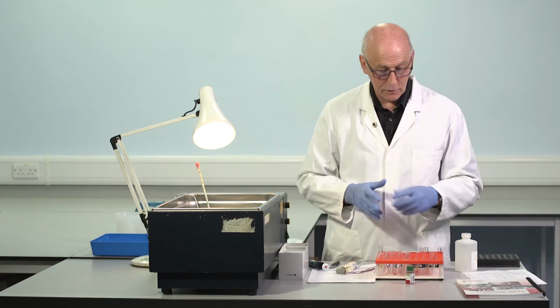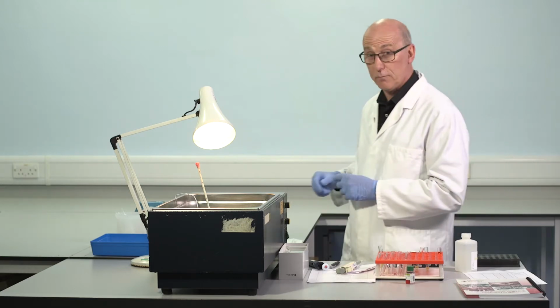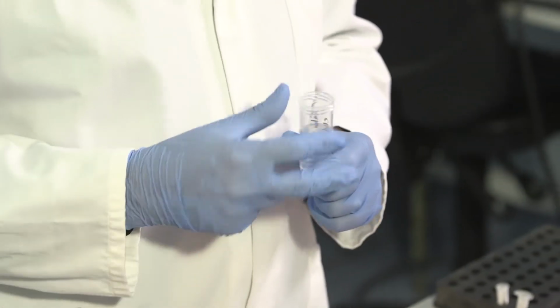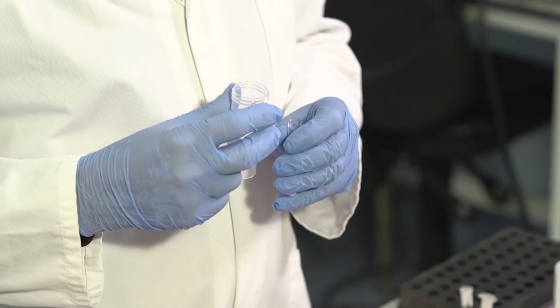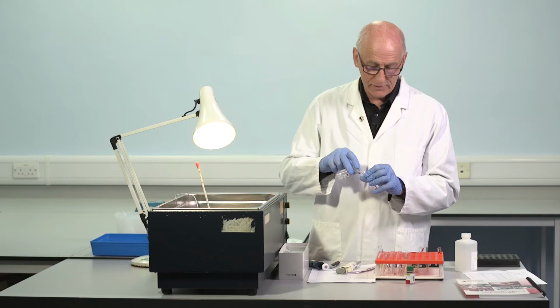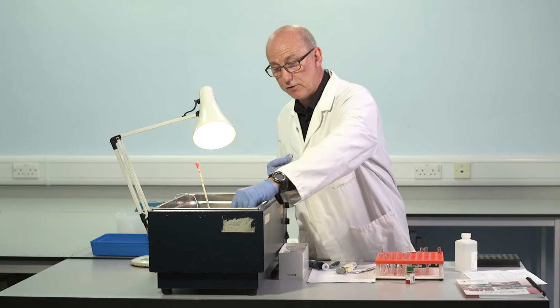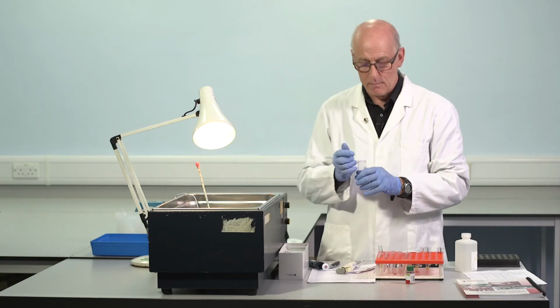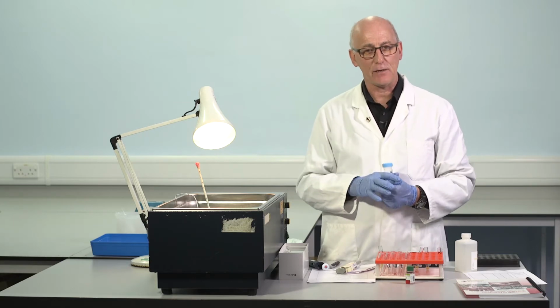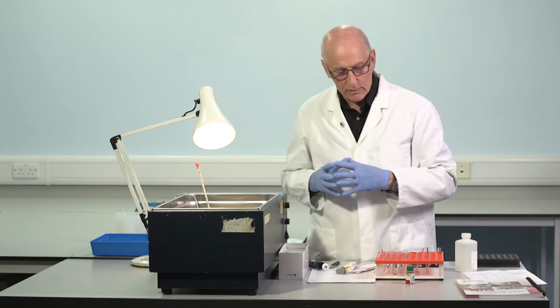At the end of the APTT, of course, we'll be recalcifying, we'll be clotting with calcium, so we also need a volume of calcium. The concentration of calcium should be the same as that used in APTT, and for the vast majority of reagents, 25 millimolar. It's a 1 in 40 dilution of a molar solution. There are some reagents which are used in combination with 20 millimolar, and again, if that's recommended by the manufacturer for use with that APTT reagent, that should also be the same here for a factor VIII assay. So these are simply warming up at the moment.